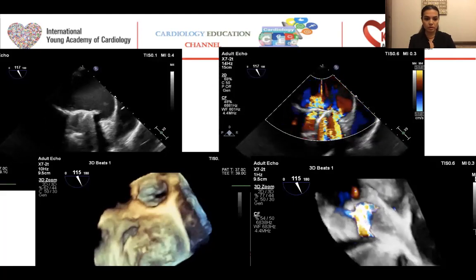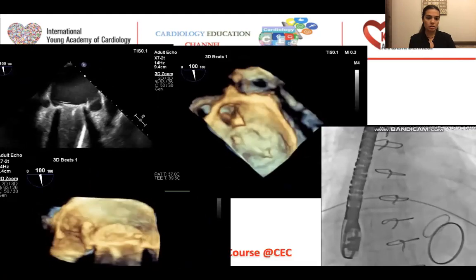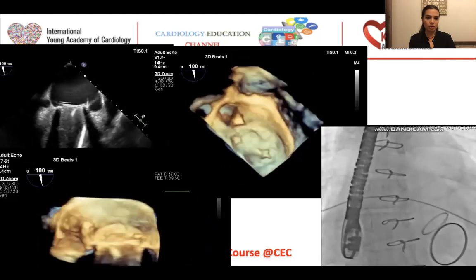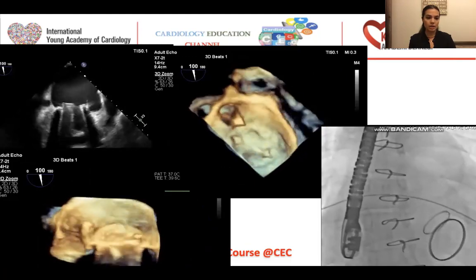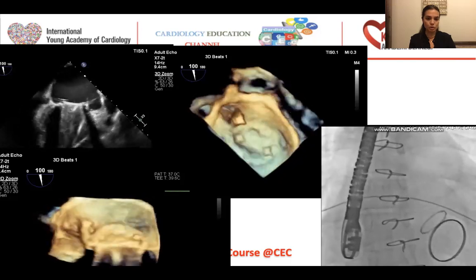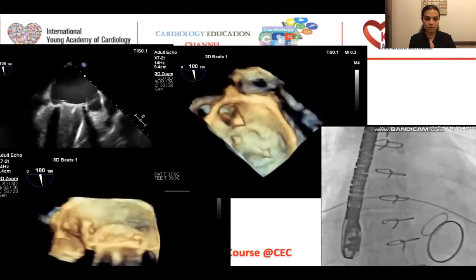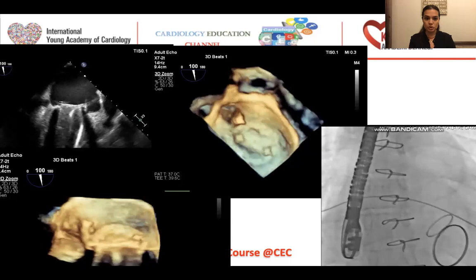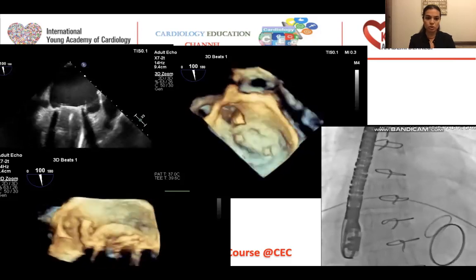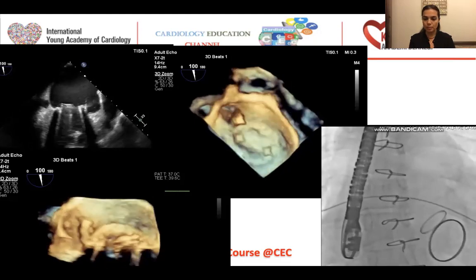to 11. And in transesophageal echocardiographic images, you can easily see that the wire had passed through the defect, both on 2D and 3D images, which located at the 9 to 11 o'clock position. We can easily understand that the wire just passed through that.